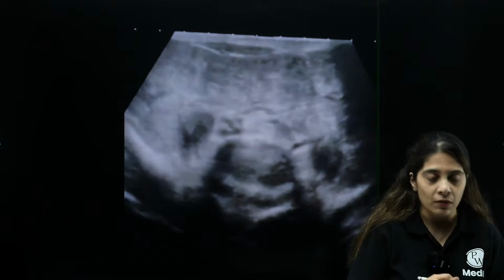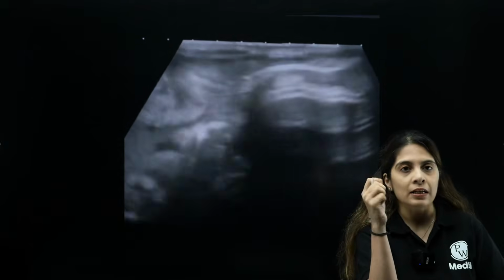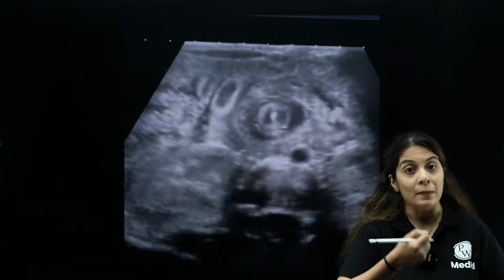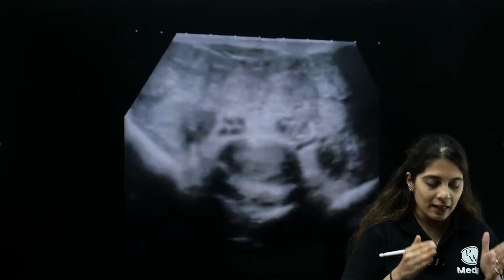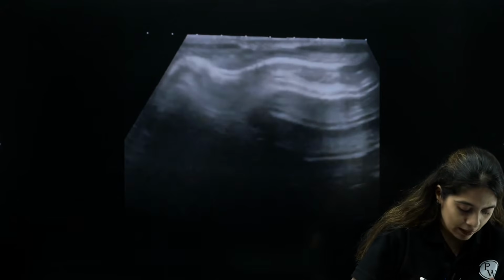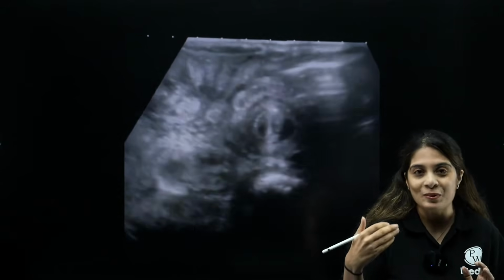What is the video showing? First of all, identify what this investigation is. This is an ultrasound. The probe has been put in the epigastric region in the midline of the baby, and you are able to see this video. Look at this video very nicely. I am going to play this video. I will be replaying the videos 2 to 3 times.